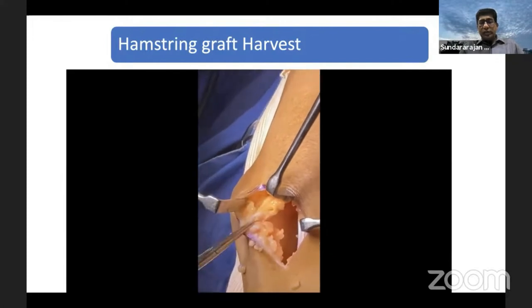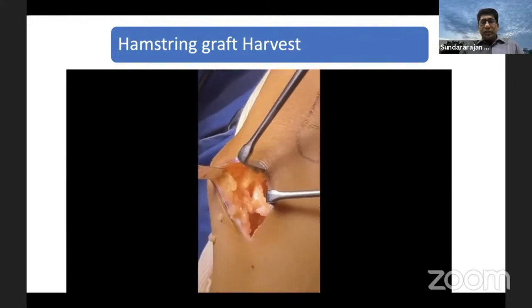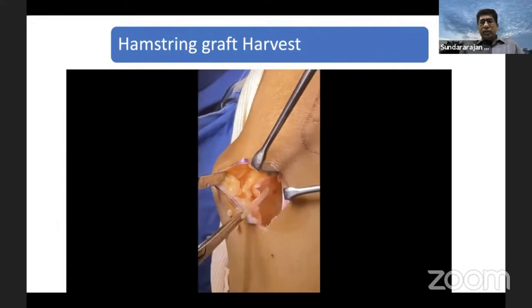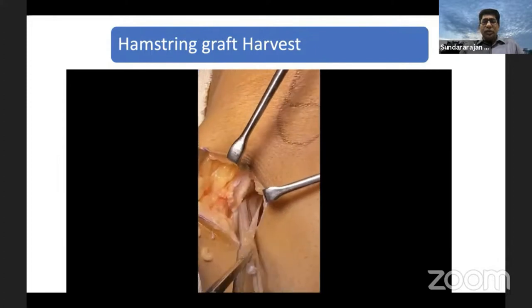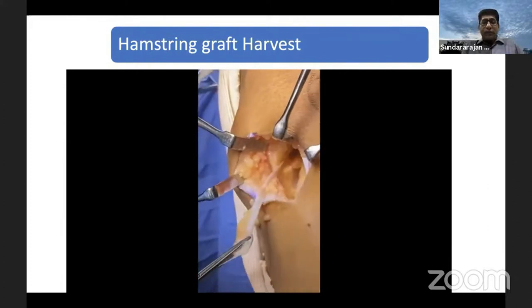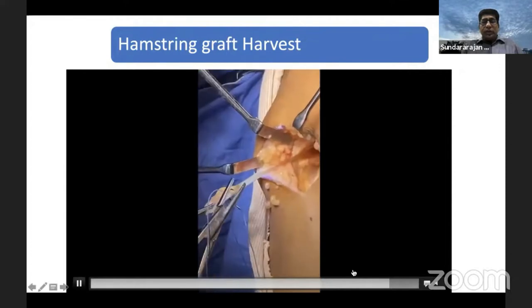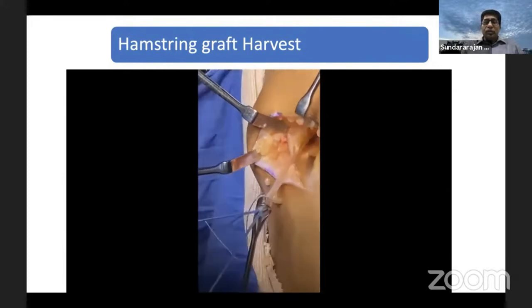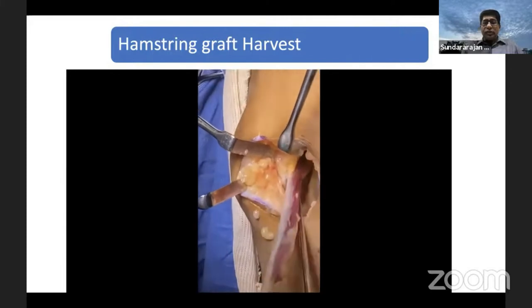Then you take the gracilis. The gracilis is proximal to the semitendinosus. Usually I take the semitendinosus, measure it, then if it is not enough I take the gracilis. It comes very easily compared to the semitendinosus. Take the stitches — it doesn't have much vinculi. Just release along with the scissor. Make sure that whenever you use the scissor, you are facing away from the graft, whether using it proximal or distal to the tendon. Make sure the sharp end of the scissor is facing away from the graft. Then same way you take the gracilis by making some loop stitches, then use the closed tendon stripper to take the gracilis graft. You should not hesitate to take two grafts because many times nowadays we use five or six strands to get that 8 to 9mm size graft.